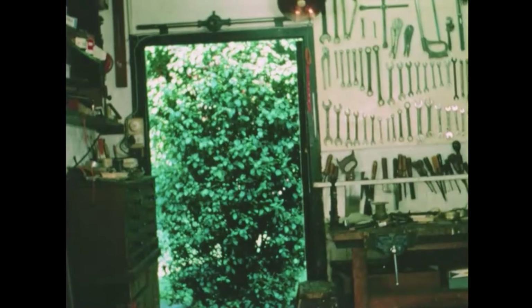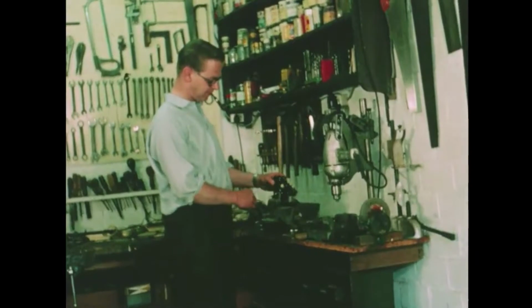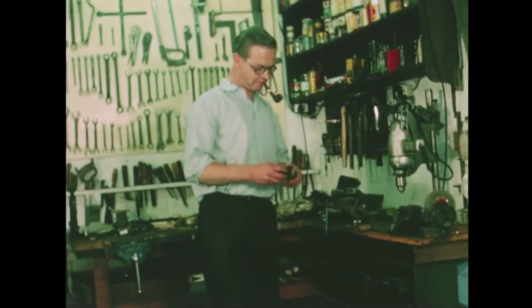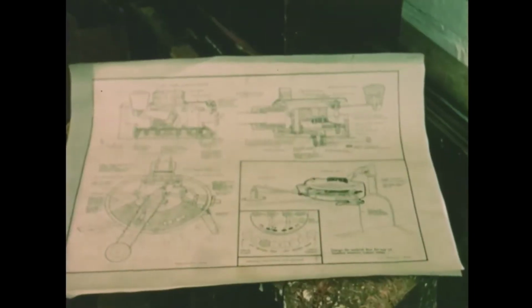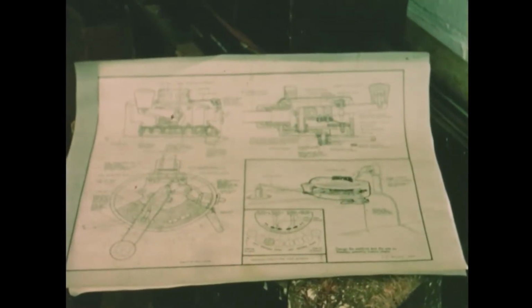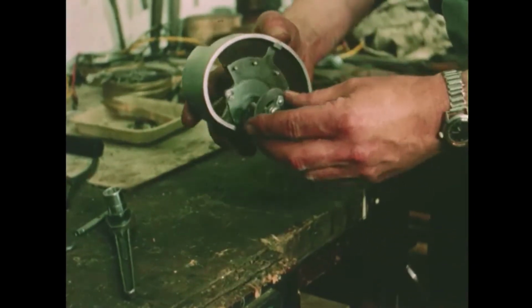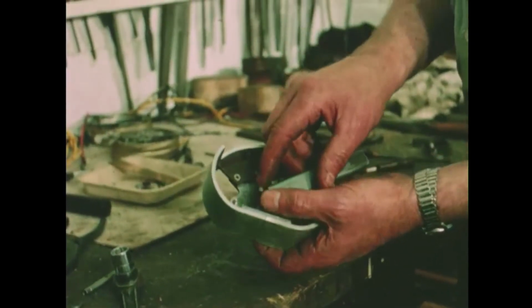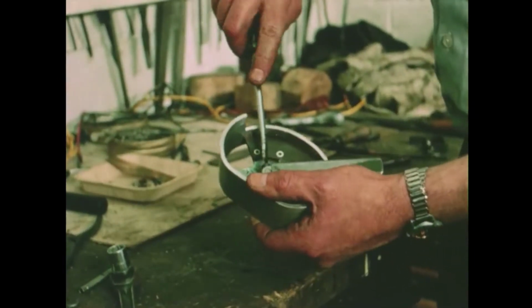He enters a workshop. There are 8 electrical contacts to relay into a control box, giving movement forwards, backwards, and turning, if necessary, on the chair's own axis. It was a difficult problem with many complicating factors. At last he did find a solution. Technical drawings of a control box. The neat oval metal box had 8 brass contacts in the floor and an arm which Frank could press down and move sideways. With his pipe in his mouth, Jack attaches parts to the control box with a screwdriver.